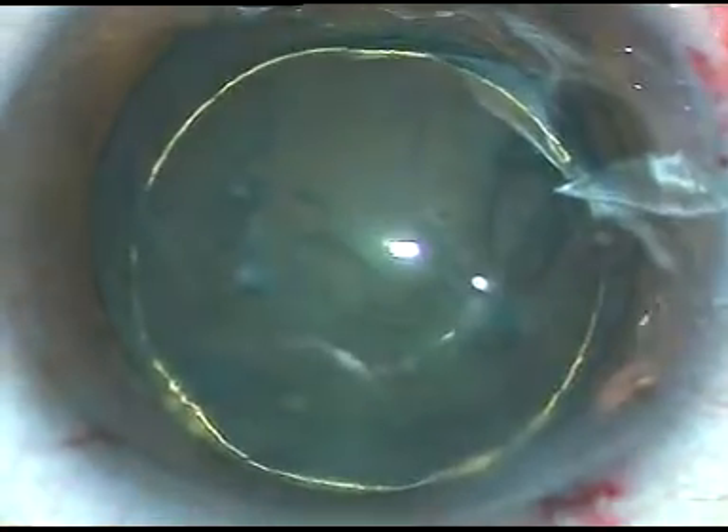In this case, hydrodissection and hydrodelineation have been done and a beautiful golden ring has formed. Hydrodissection is not very good but doesn't matter — it will occur as I play with fluid inside. Now see how the nucleus comes. I am just playing with the tip of the phaco handpiece, sometimes beveled down, sometimes sideways.